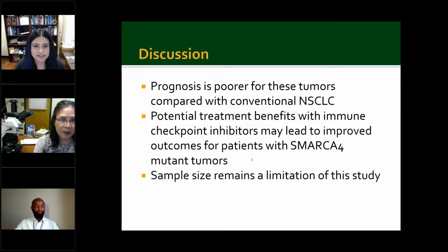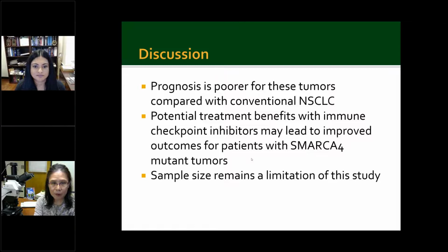What about you, Dr. Lin? Is that your top line diagnosis as well? Yeah, we have to follow the new WHO guideline, WHO terminology. But before, I would sign out just saying non-small cell lung carcinoma, then see comment with this or that mutation. Because with NGS, you may not test only one mutation, they may have some other mutation too. That's true, yes. And I think that's the advantage here to having the BRG1 stain, that it is something you could potentially include in your diagnosis before it goes for NGS.